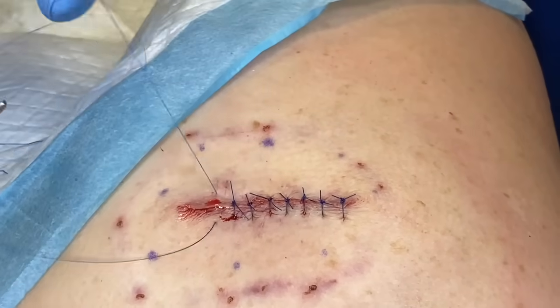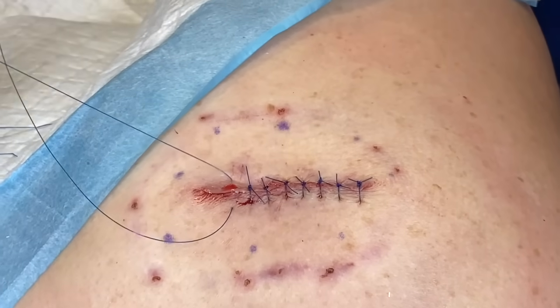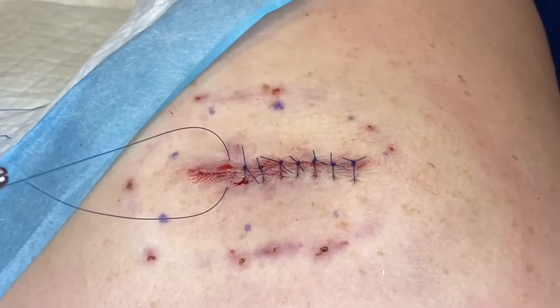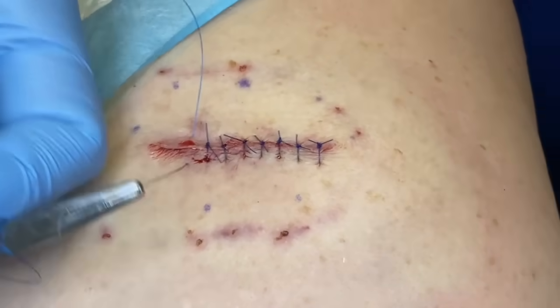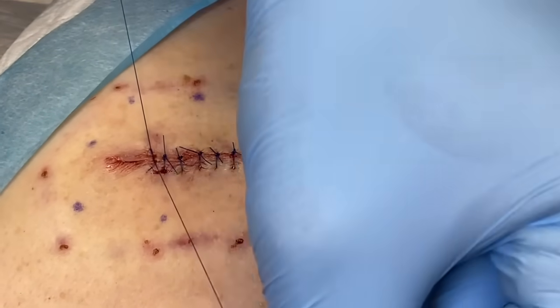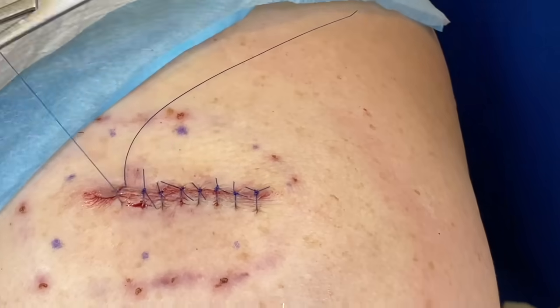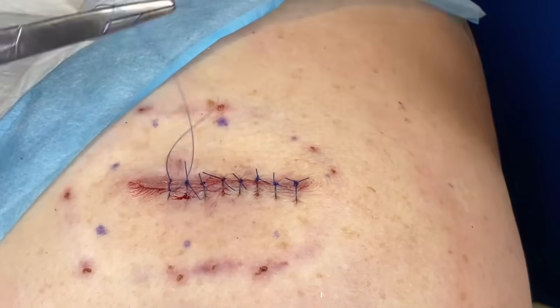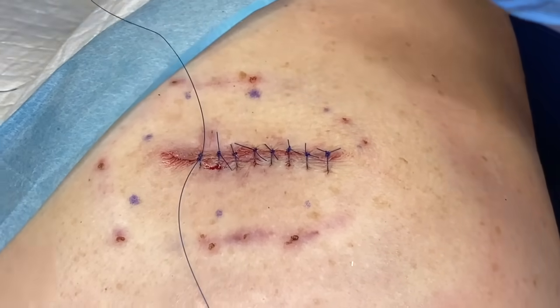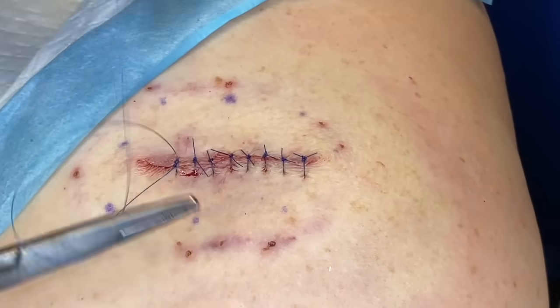So again, same issue will happen there. I'll have lots of young residents whose angle's completely off and they feel committed to it. They don't want to admit that they could just reposition it. At least you acknowledge it's my thread you're wasting, so it's good. It doesn't matter in these cases, because you can look at how many stitches you're going to have to put in, 2 or 3, so you have extra thread. It's not a big issue.